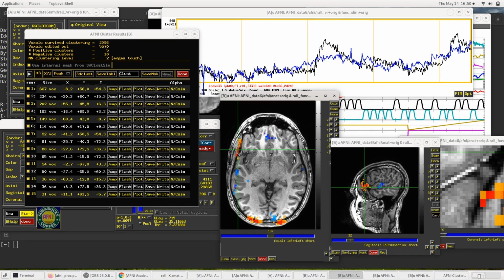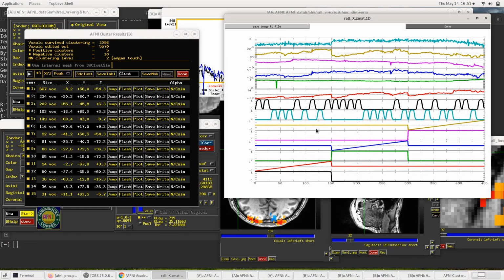So if the subjects are showing videos of people speaking words, they might squint a little bit to possibly feel like they're improving the vision, cutting out the excess light to maybe see a little more clearly. Or it could be a slight clenching of the teeth or something like that. Either one of those could produce some sort of muscle movement, and if that happens in time with the stimuli, that's going to be something that our model is going to pick up. If it happens in this on and off pattern reasonably well, we're going to see that.